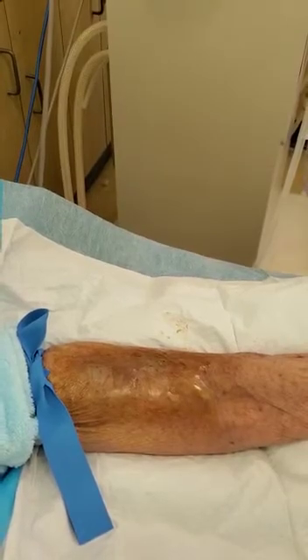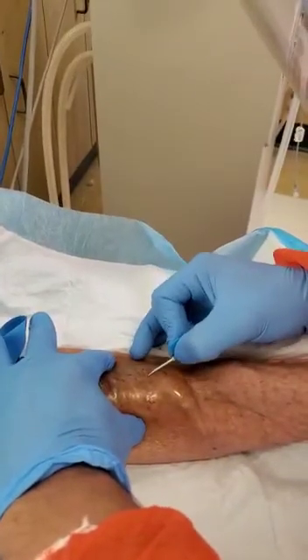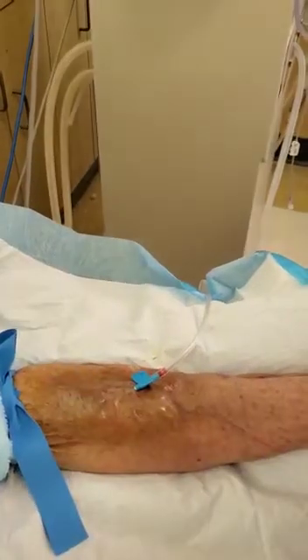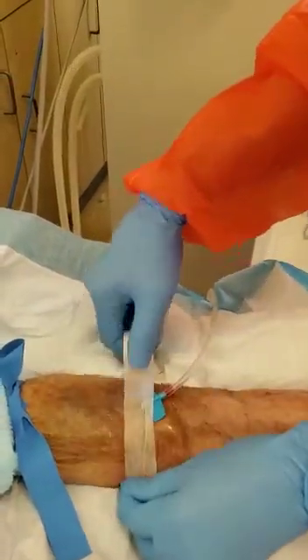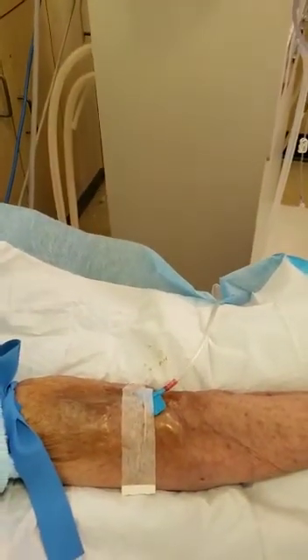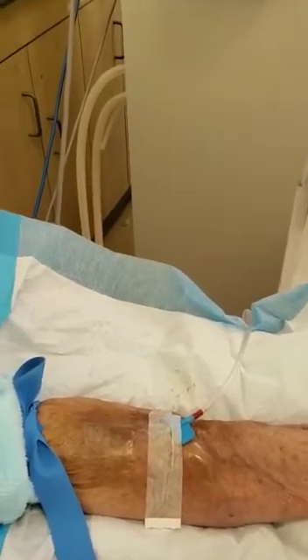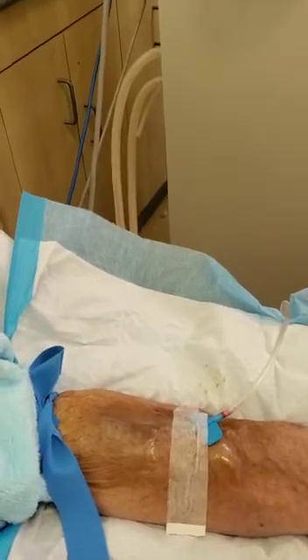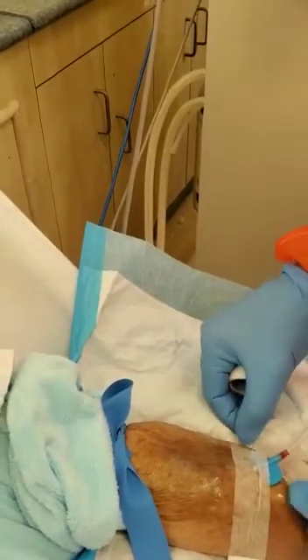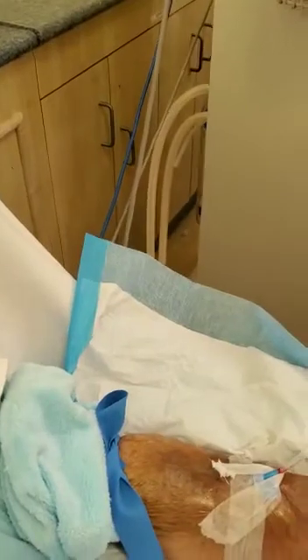First he's going to cannulate the arterial site. He's going to secure that needle — that's your wing or butterfly technique.